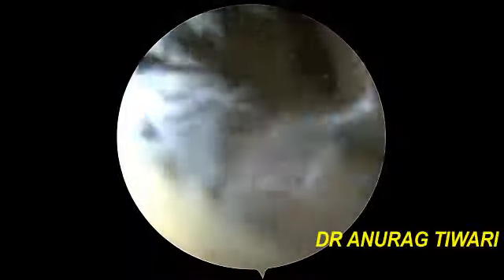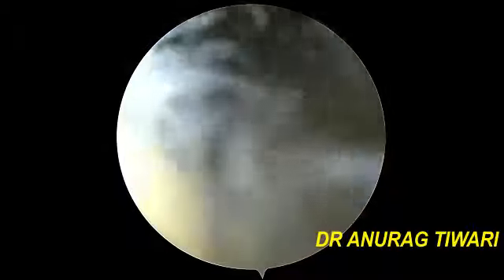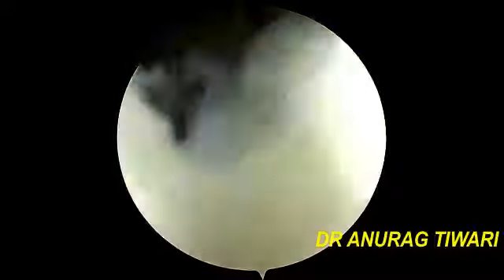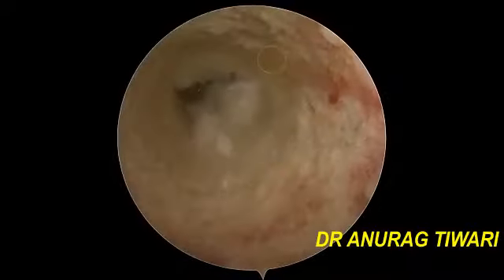So the reaming has been completed. You remove the reamer. Be careful when you are reaming the tibial tunnel that the camera should not be in the path of the reamer, otherwise you can damage the lens.